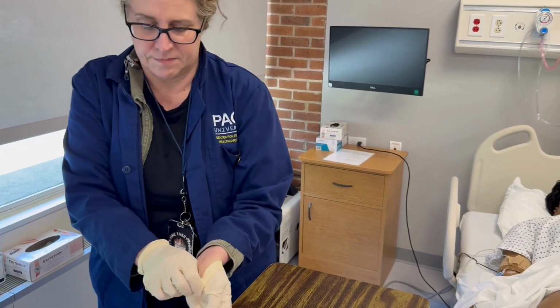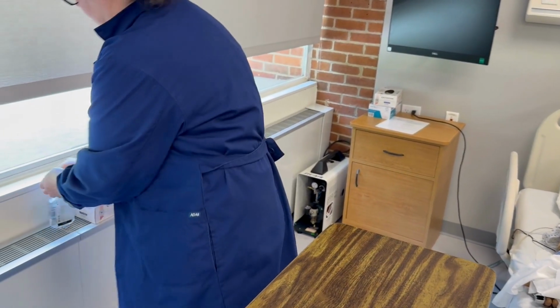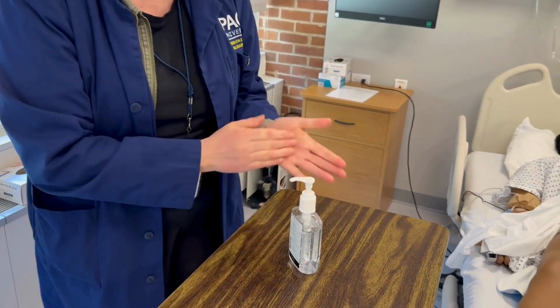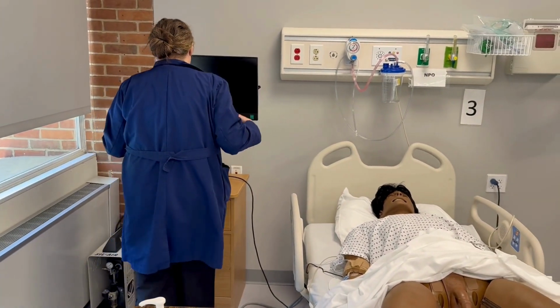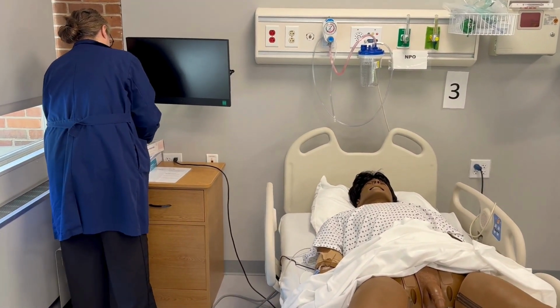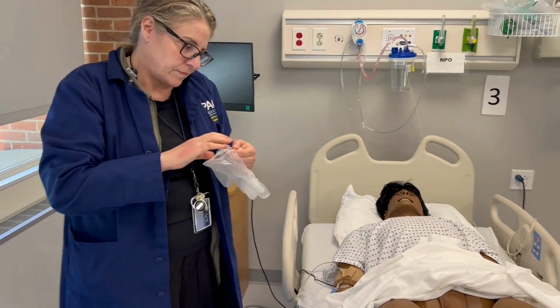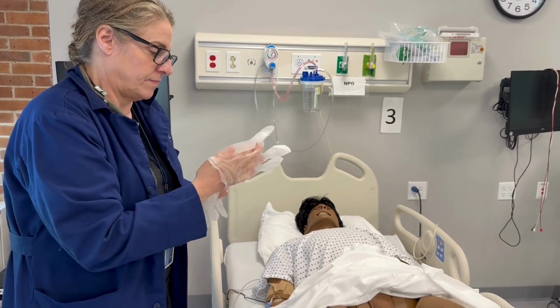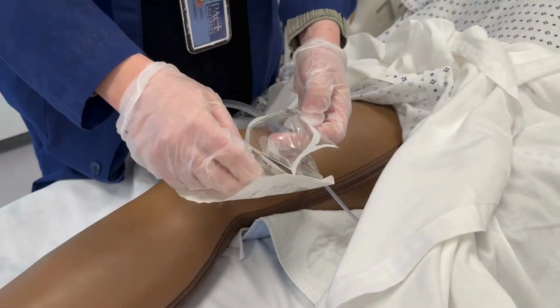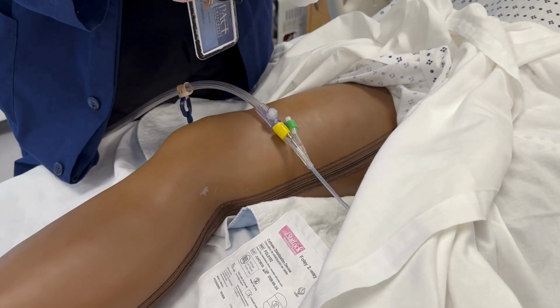Remove soiled gloves and perform hand hygiene. Put on clean gloves. Secure catheter tubing to the patient's inner thigh with a catheter securing device.